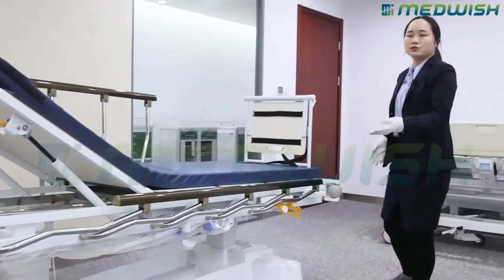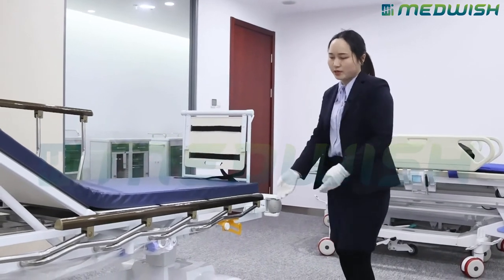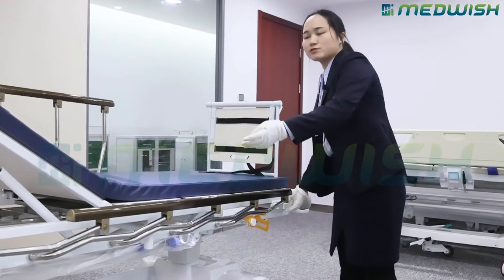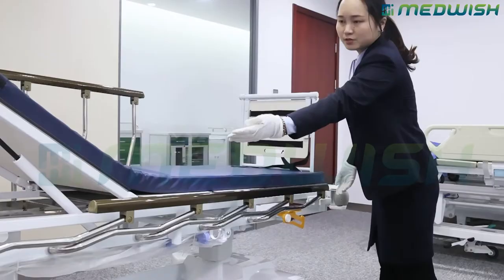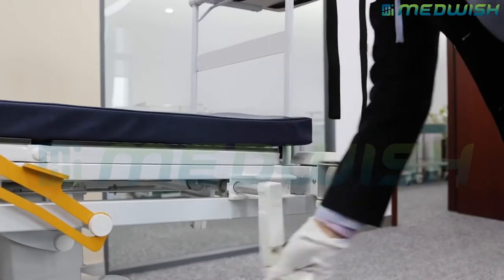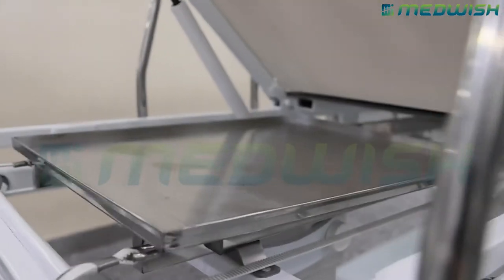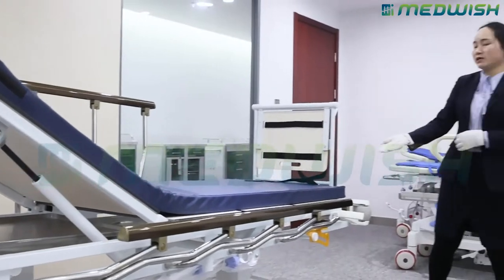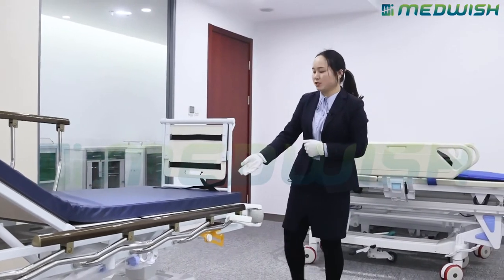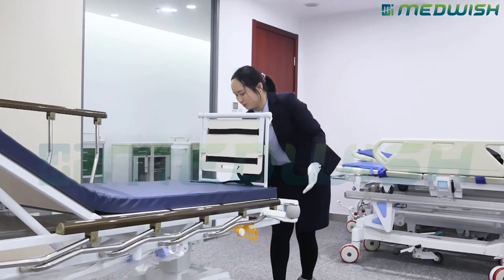There are also two cranks on the stretcher. The first disc crank controls the X-ray cassette holder under the bed board. The second crank at the foot position controls the foot section of the bed board.